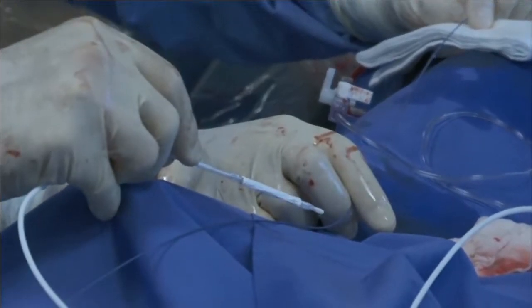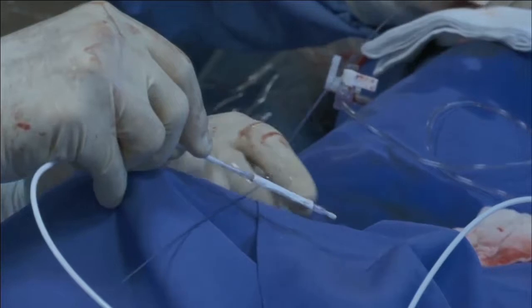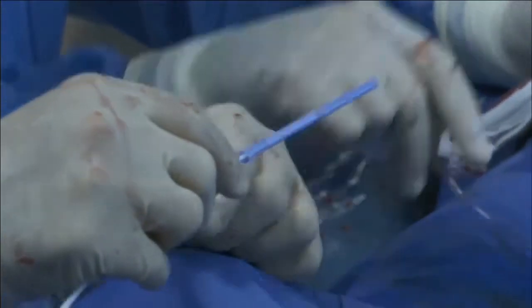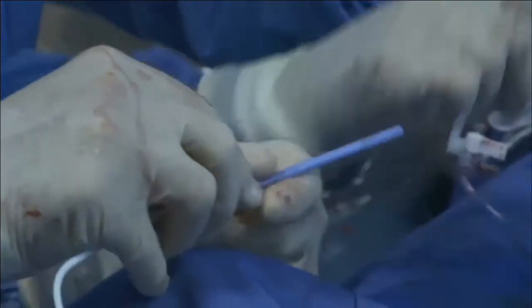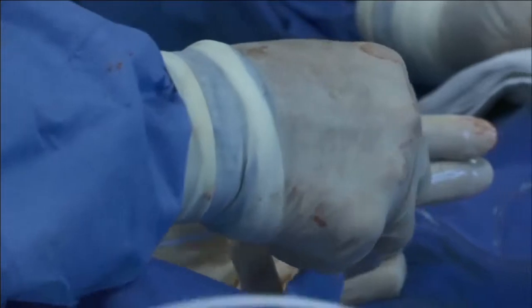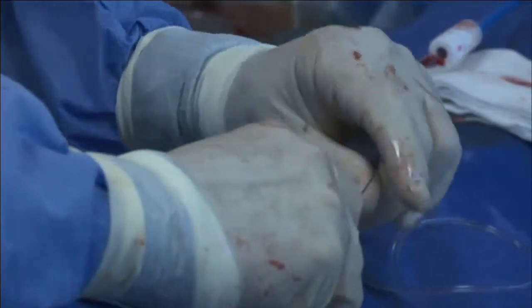John, as you may see here, we have the CP covered stent pre-mounted on the balloon we have chosen. There is a nice sleeve to avoid any problem when passing through the valve of the long sheath. So we are ready to pass the valve of the long sheath. We put the valve in the ascending aorta, and now we are going to be ready to pass through the valve of the long sheath.